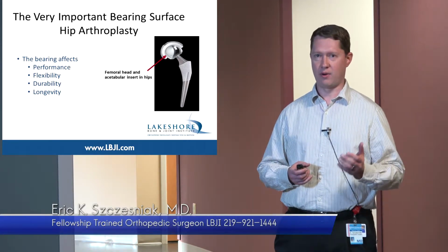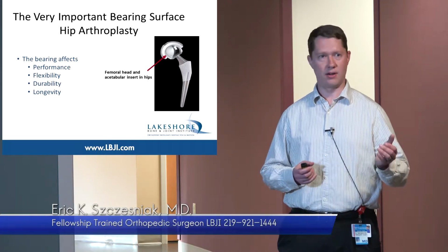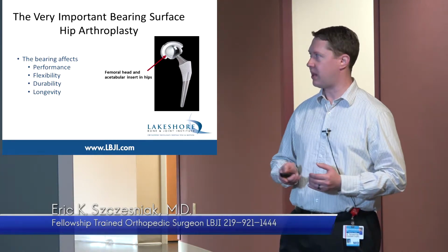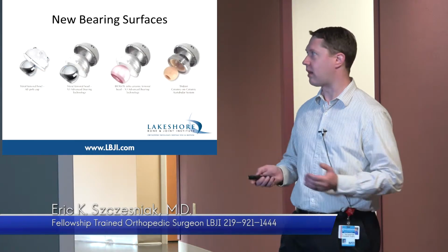But the interesting thing is, unfortunately, wear and mechanical strength tend to be opposite. So it has to be so strong to deal with the forces of the hip joint, but the stronger it is, the quicker that material tends to wear out. And so it's been a balance of trying to balance that mechanical strength and that wear.